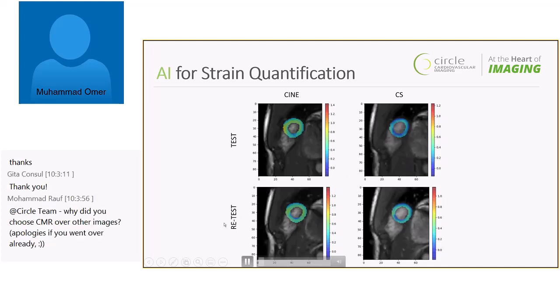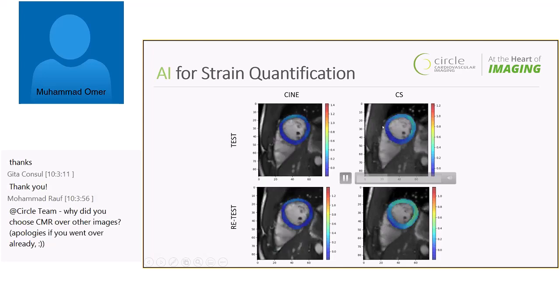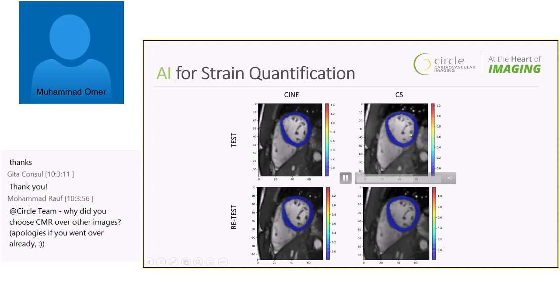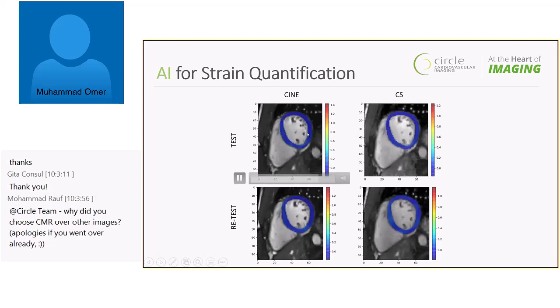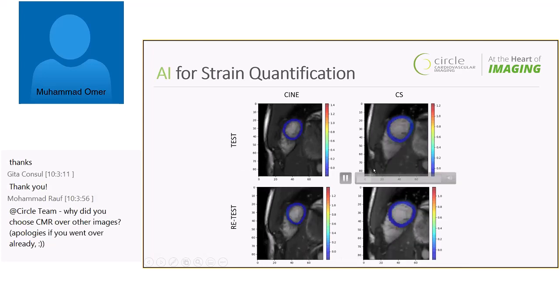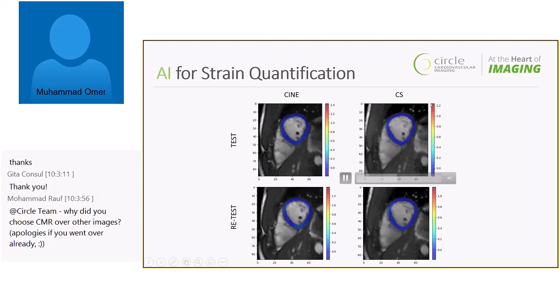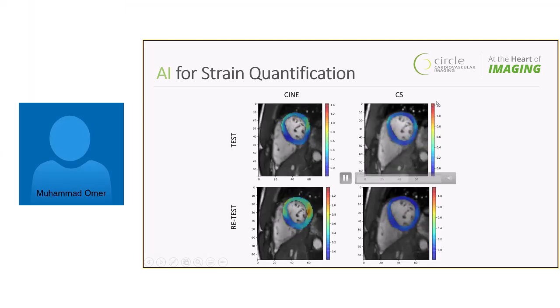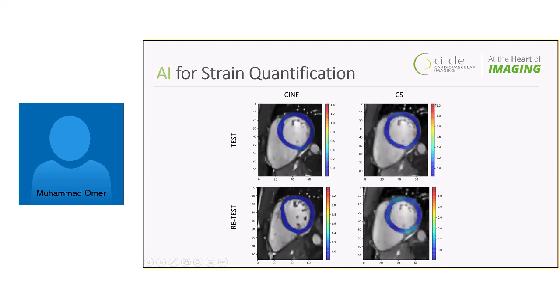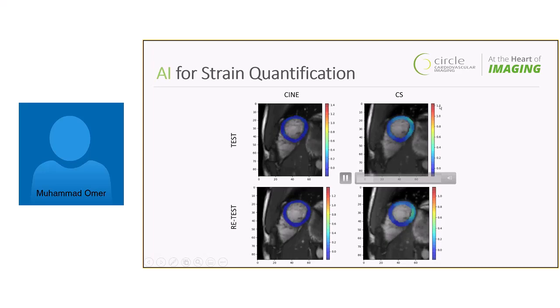That is validated here, as we can see that all of these images show similar patterns throughout the cine display of the CMR images. There are some differences in the quantified numbers where the compressed sensing images have slightly underestimated strain values, but those are still being considered for further improvements.